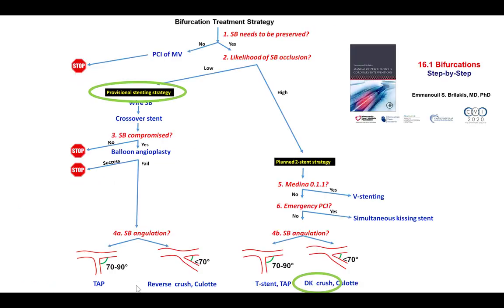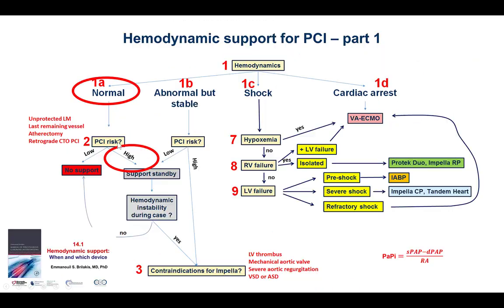When it comes to bifurcation stenting technique, there are two key strategies: either a provisional or a planned two-stent strategy. In this case, we decided to go for provisional because there did not appear to be significant disease in the ostia of the LAD, circumflex, and ramus. And of course, there is always the option of putting a second stent if there is a compromise of the side branch, which are wired before placing the stent.